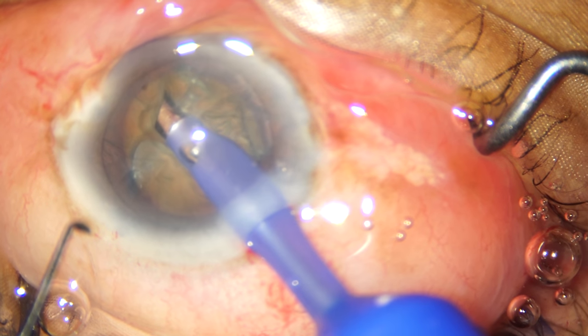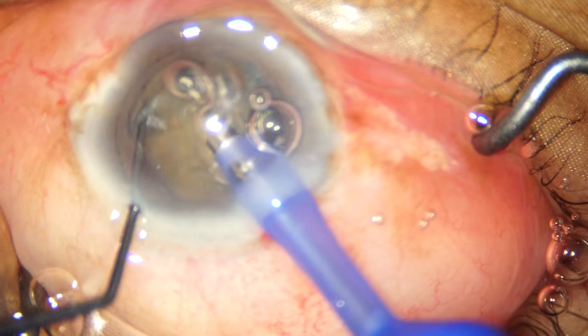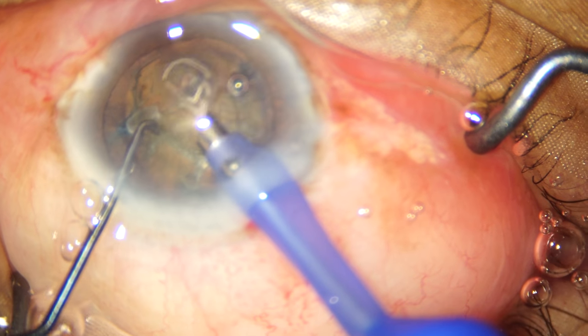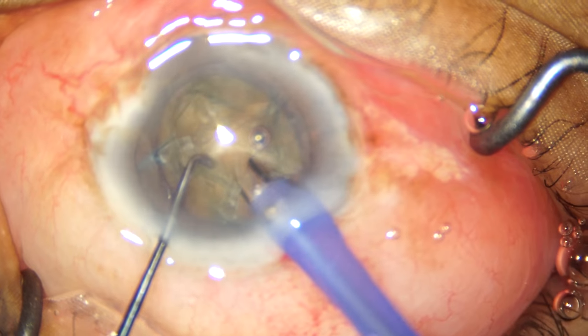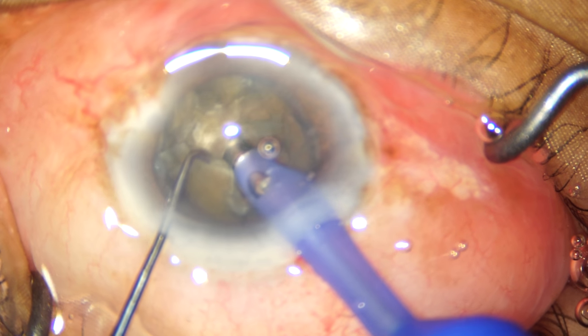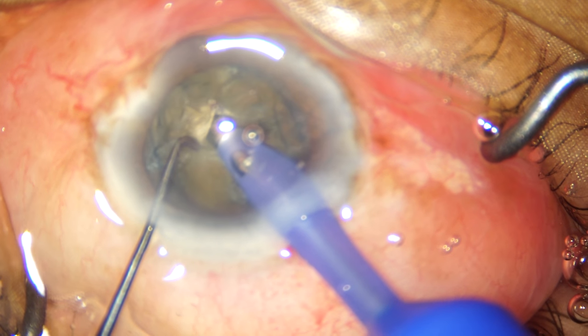We're going to approach this nucleus with a direct chop technique, and we're doing a slight modification of this technique in the sense that we're making a trench on one side, and after rotating the nucleus 180 degrees, we're going to embed our phaco tip into this partial trench and then attempt a direct chop.